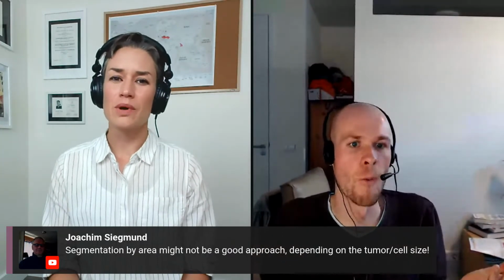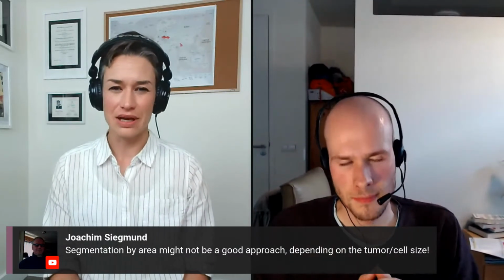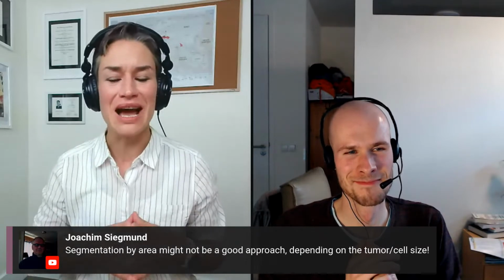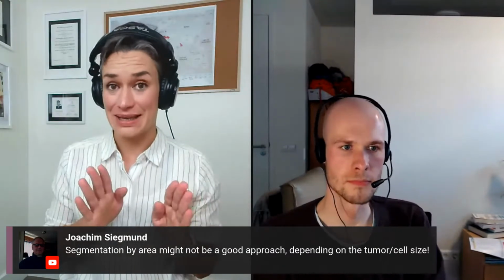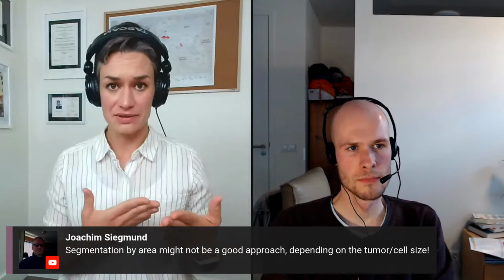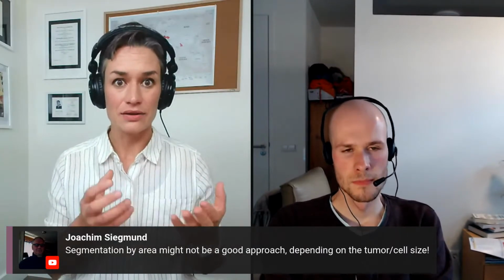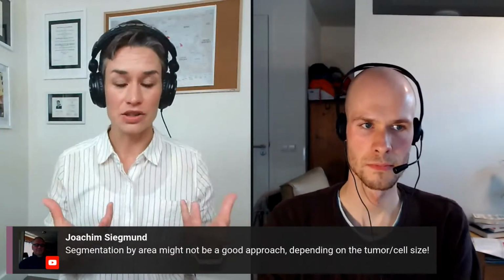So this is still an open question. I was wondering, when they were designing those scores for the clinical trials and those cutoffs, if anybody in the audience is the pathologist that did that, please contact me. I want to know how you did that because, in contrast to Ki-67, where you actually have to count 500 cells or whatever the number is for the MD pathologist, there is a number of cells that you have to count, and you go and count it. And like Leslie just said in the previous lecture, people actually go and do it.